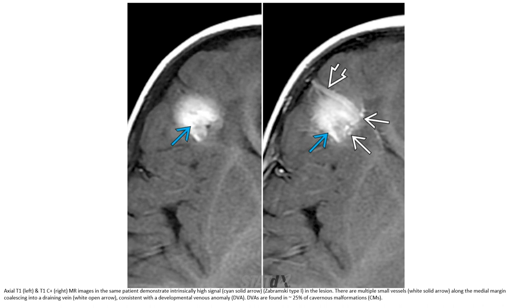T1 and T1 post-contrast images of MRI in the same patient demonstrate initially high signal in the lesion. There are multiple small vessels along the margin draining into a developmental venous anomaly. Developmental venous anomalies are found in around 25% of cavernous malformations.